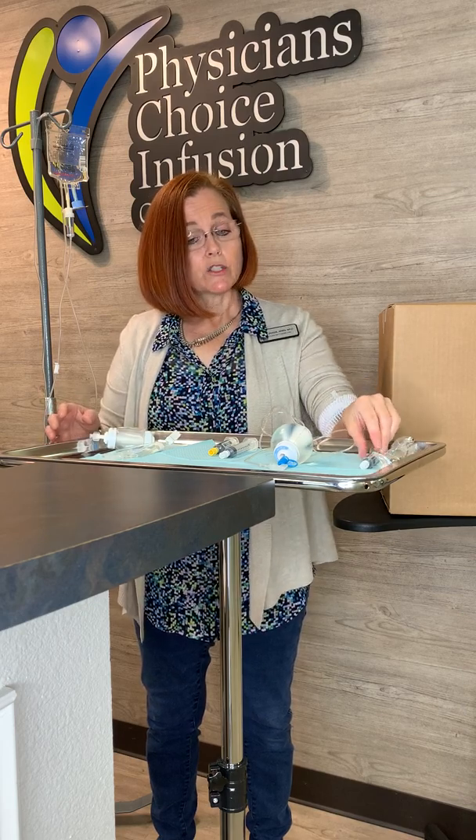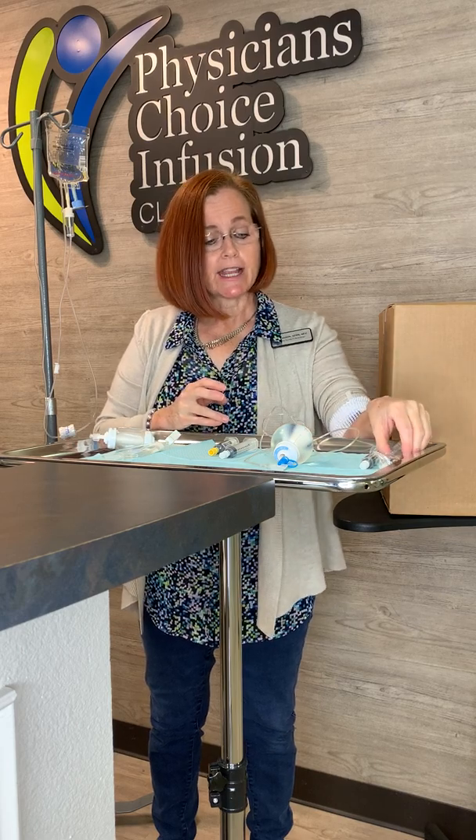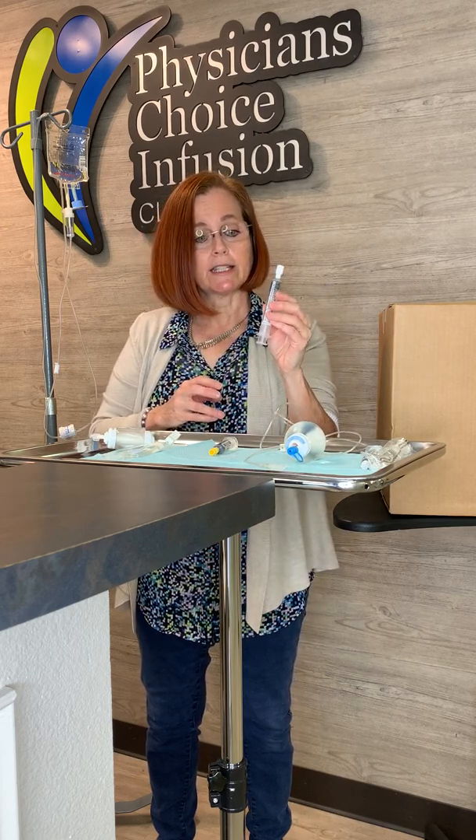When that time has passed and it's warm, you want to set everything up. First, wash your hands well with soap and water, and then we're going to use the SASH protocol. S stands for saline, A stands for administration of medication, S stands for saline, and H stands for heparin.